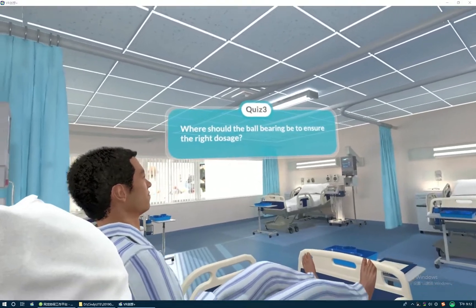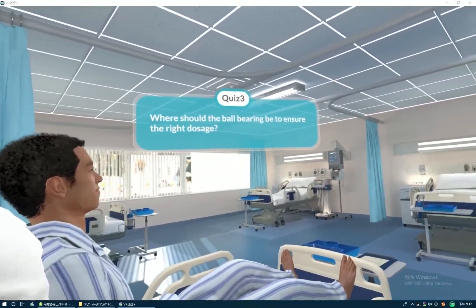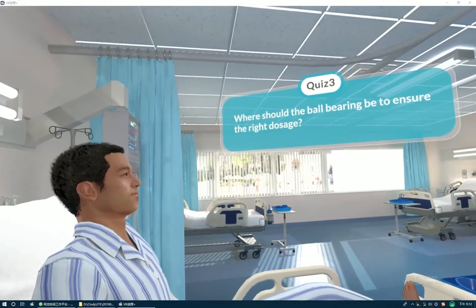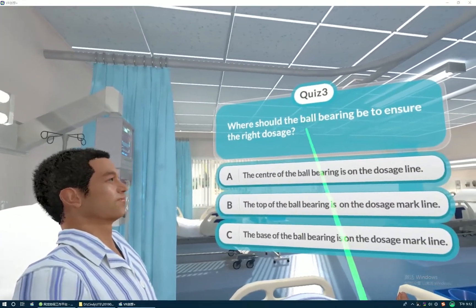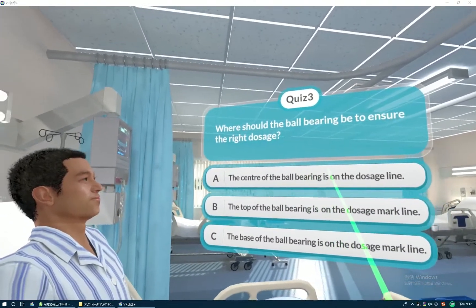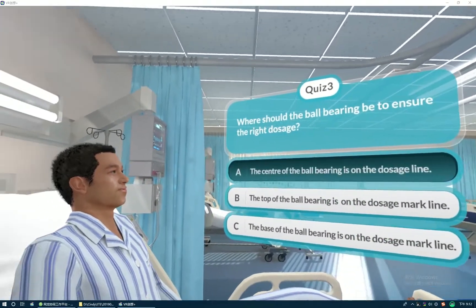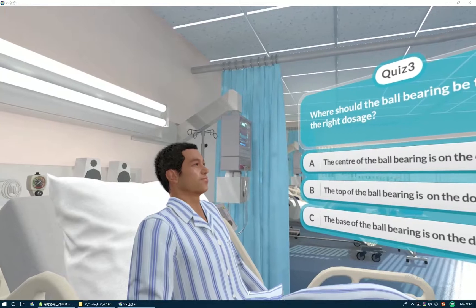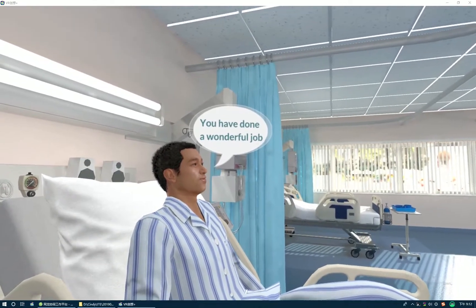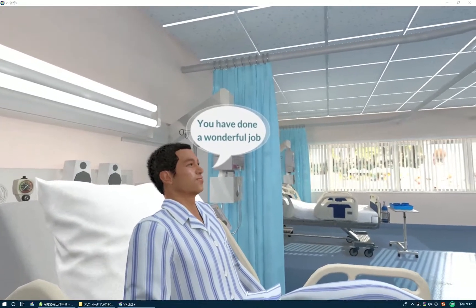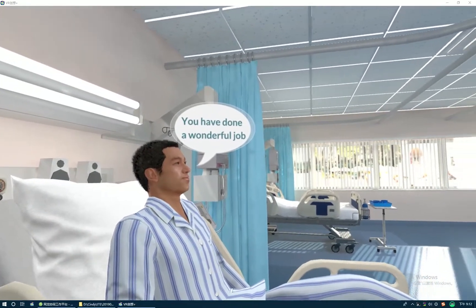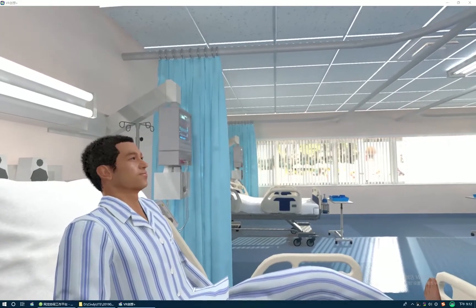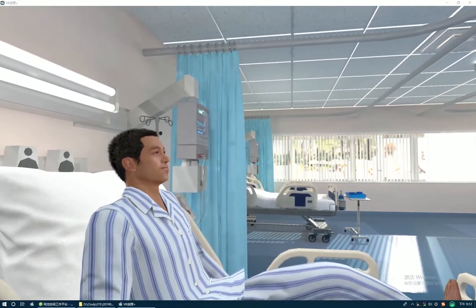Where should the ball bearing be to ensure the right dosage? You have done a wonderful job. Moving on.